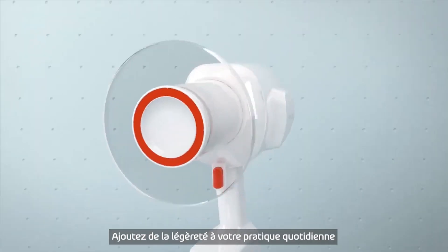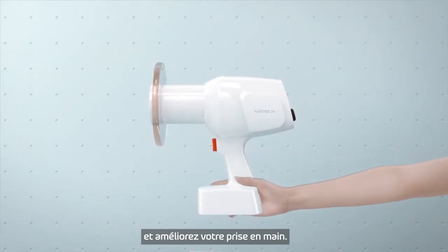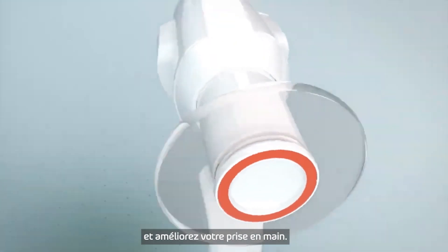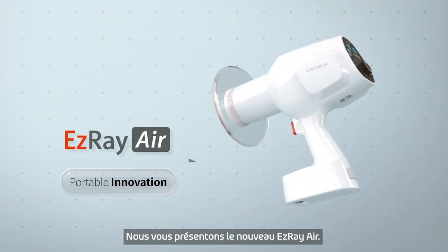Adding lightness and mobility into our lives. Go upgrade. Lightweight. Portable. One-handed grip. Let us introduce the all-new EzRay Air.